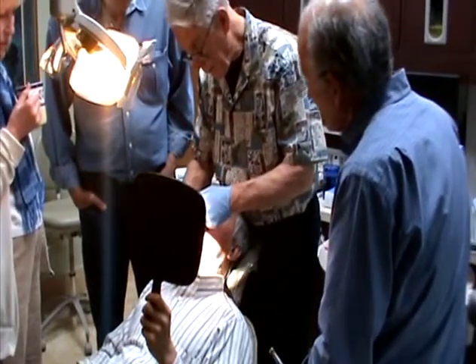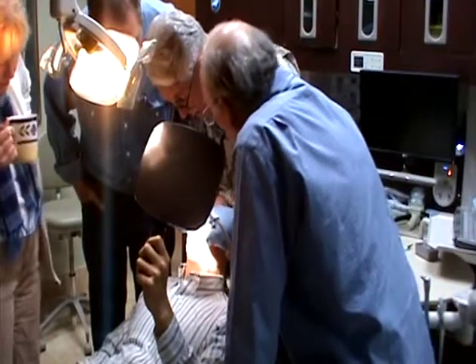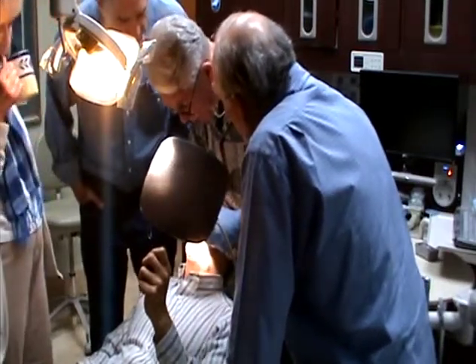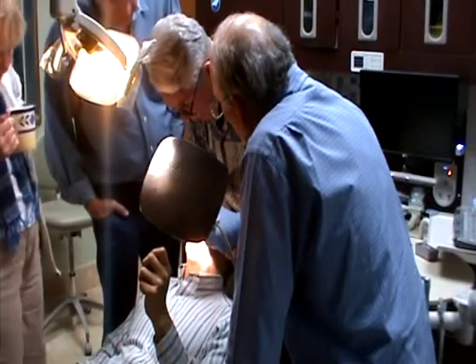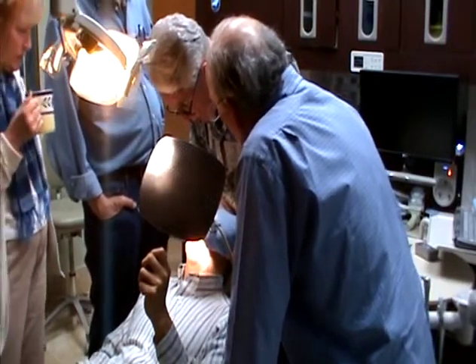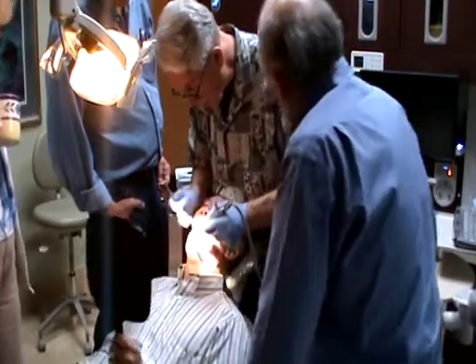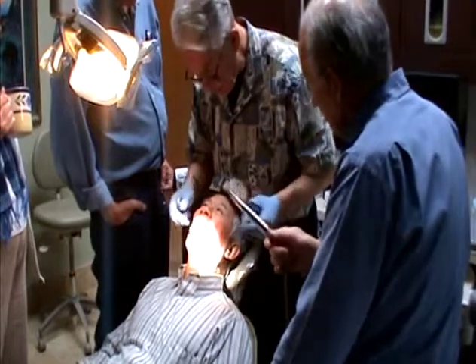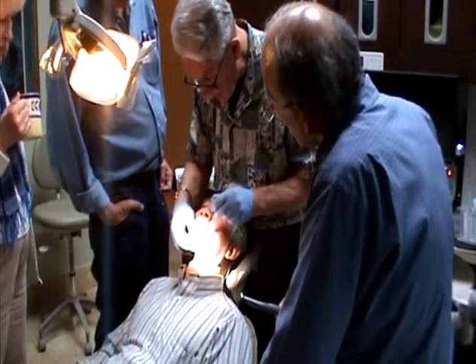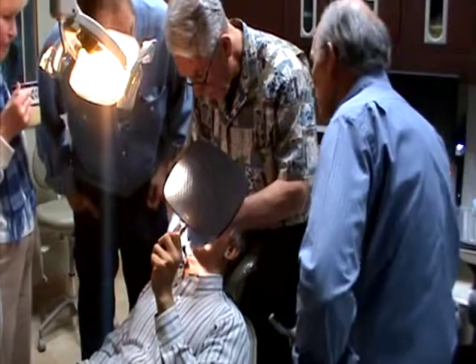And right now, slide over. So where's it hitting on the lower? Right up across here, this thing here, of course it's that buildup. If you look, this cusp is sticking way down. But we're not touching that centric stop. The centric stop is right here. And we're back here, so when he slides across that thing, he's supposed to be sliding off to the side. But he's got a problem right now, because he's not got any cuspid guidance, slides to the left. So he's got that all ground out right here. This is all ground out right here. So he doesn't get anything there, I don't think. Oh, and it's cutting right now.